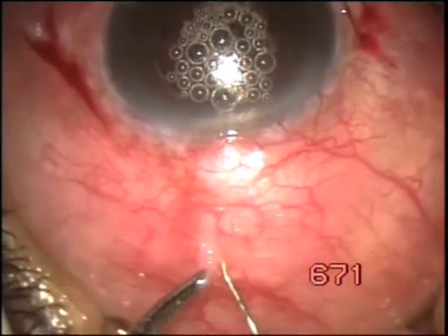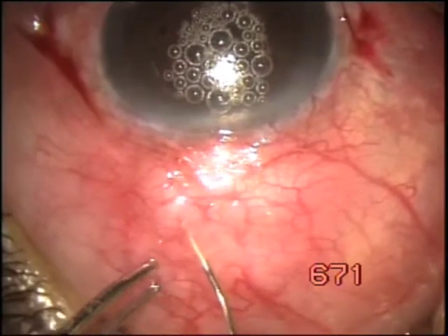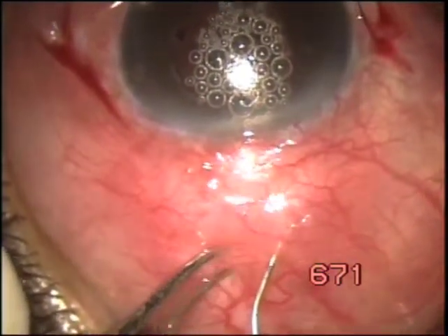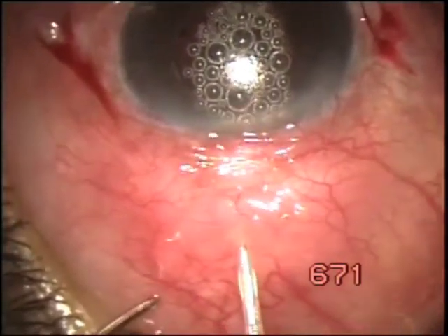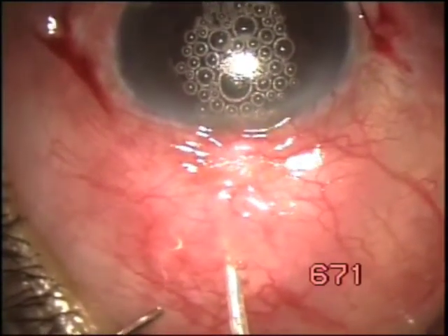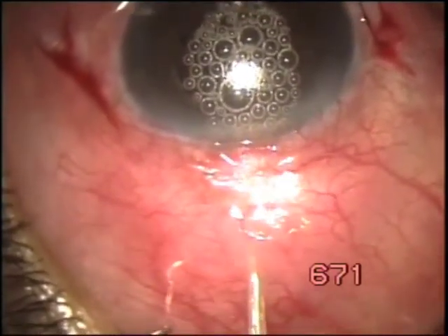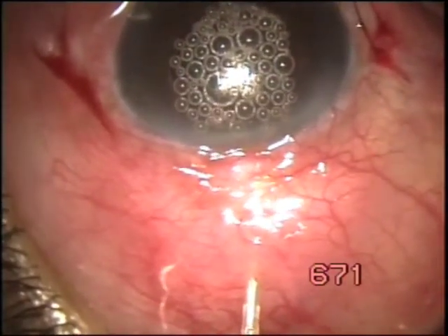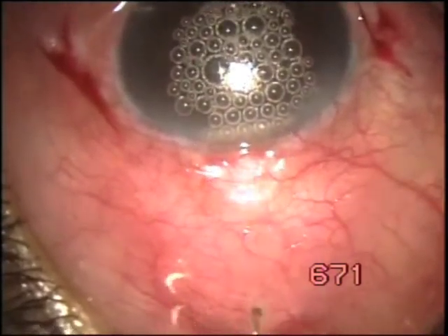Then inject mitomycin 0.01 percent in saline around the edges of the cyst. Once again you may use the Fugo blade to destroy the remaining standing wall of the Tenon's cyst.